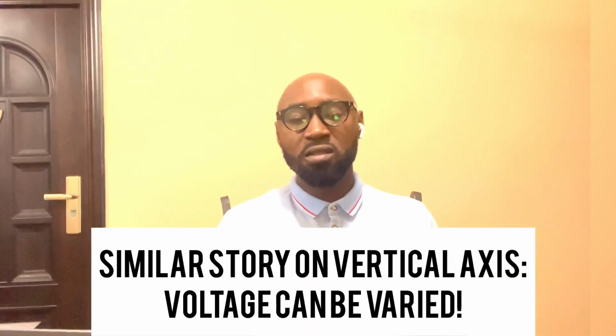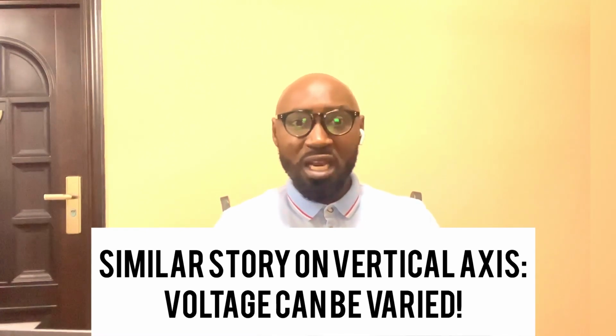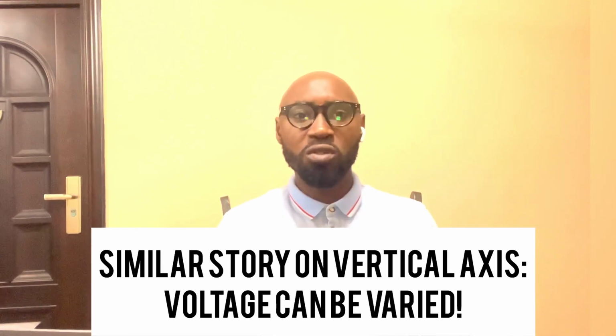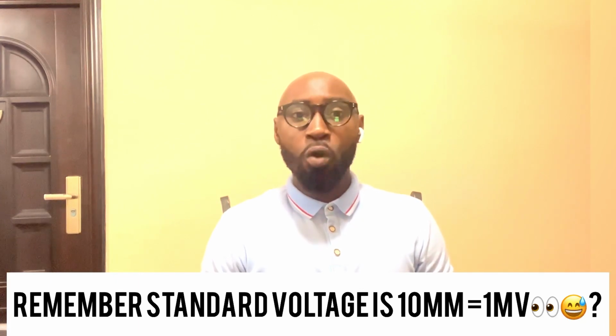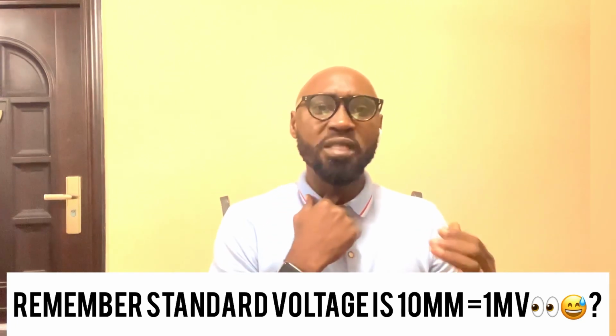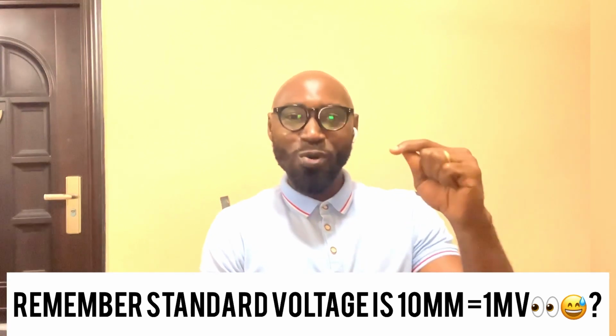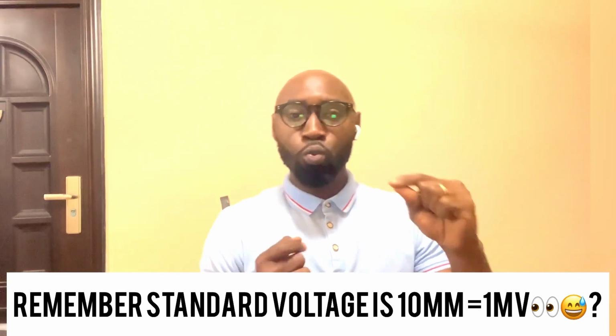Similarly, on the vertical axis that measures the voltage, we are also able to either increase the voltage or decrease the voltage if necessary. Although we have stated that the standard voltage is 10 millimeters to be equal to 1 millivolt, 10 millimeters, that is two large boxes being equal to 1 millivolt, it is possible to increase that voltage or decrease that voltage depending on the particular situation.